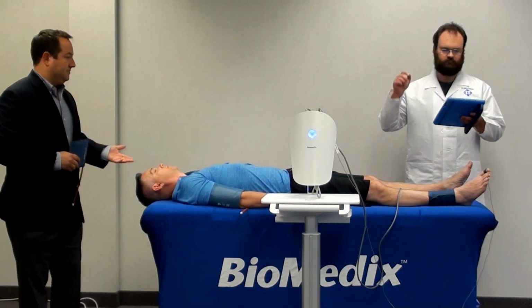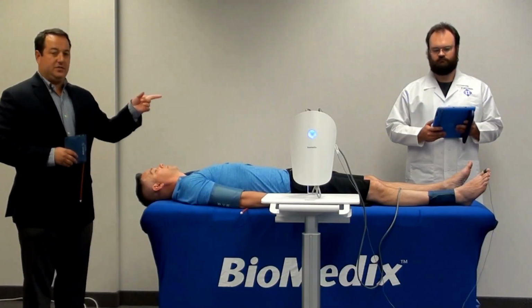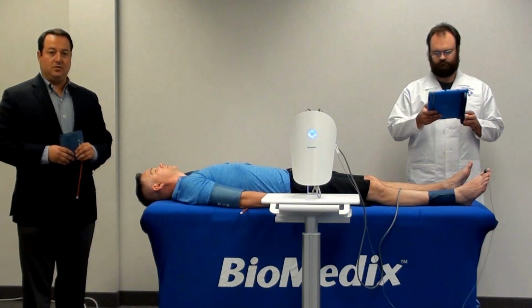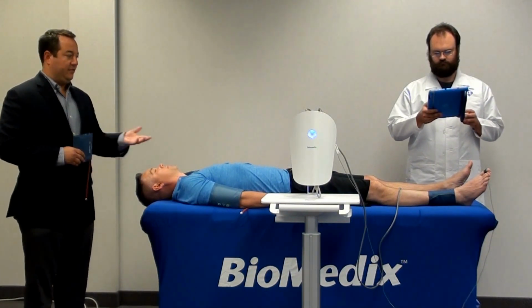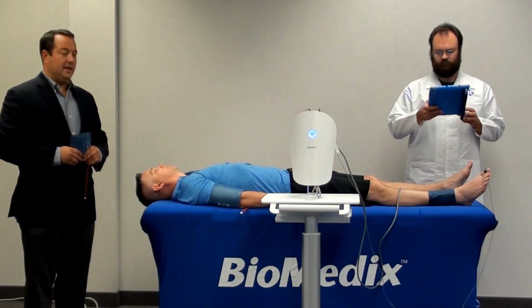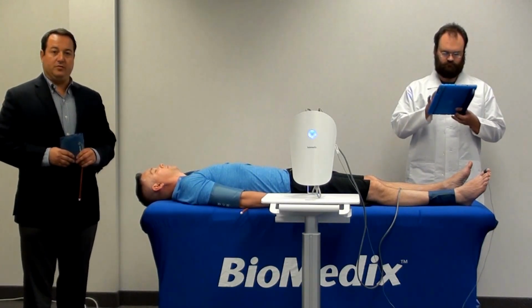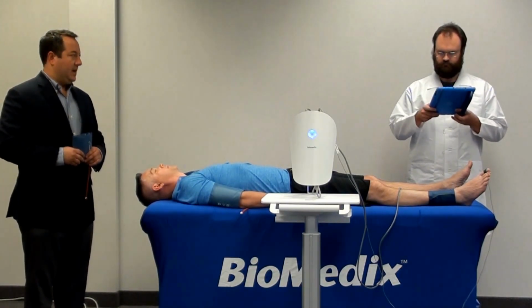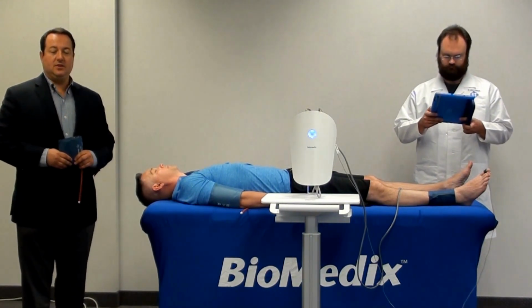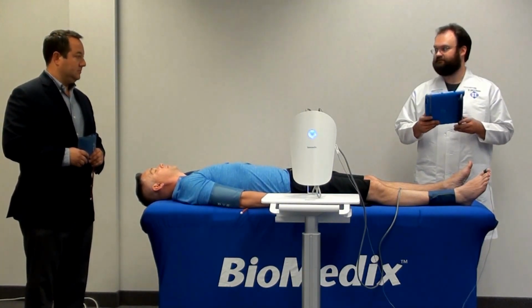Our patient is Chris, and you can see on his ankle we've got the pressure cuff, and on the toe we've got a PPG probe. This PPG probe gives a visual of the return to flow. The cuff is acting as a tourniquet. The inflation and deflation of the cuff takes under a minute with the PADnet 4.0 device. And Eric is simply clicking Start, Save, and Next. So the software is very intuitive. The pressure's been taken. Great.